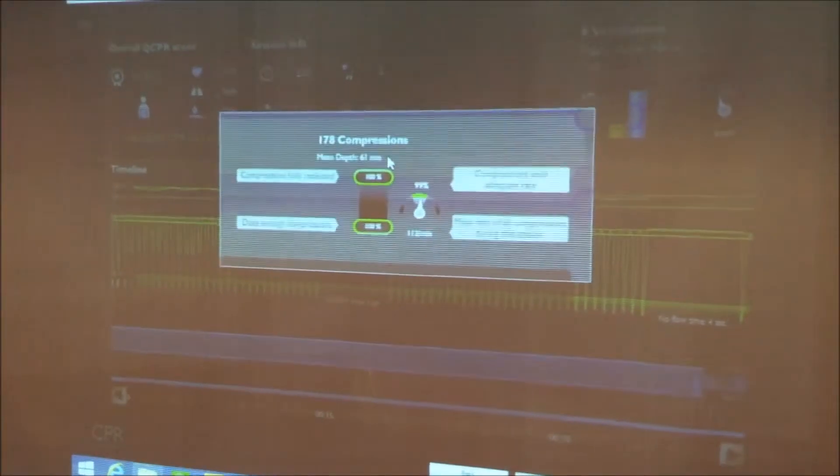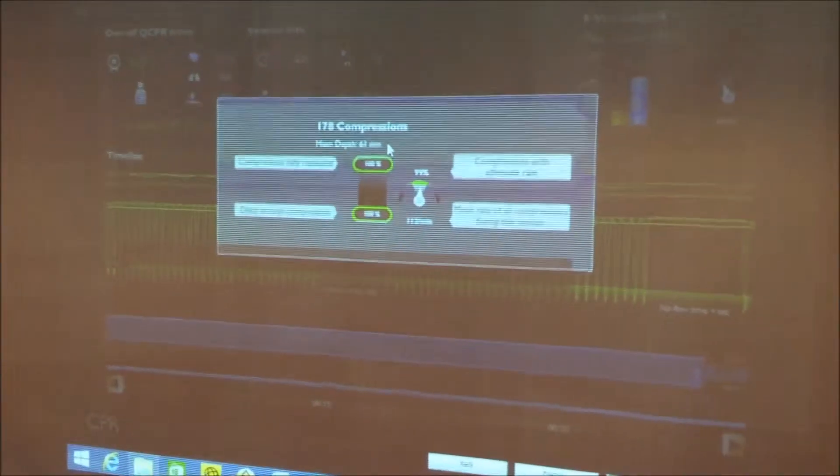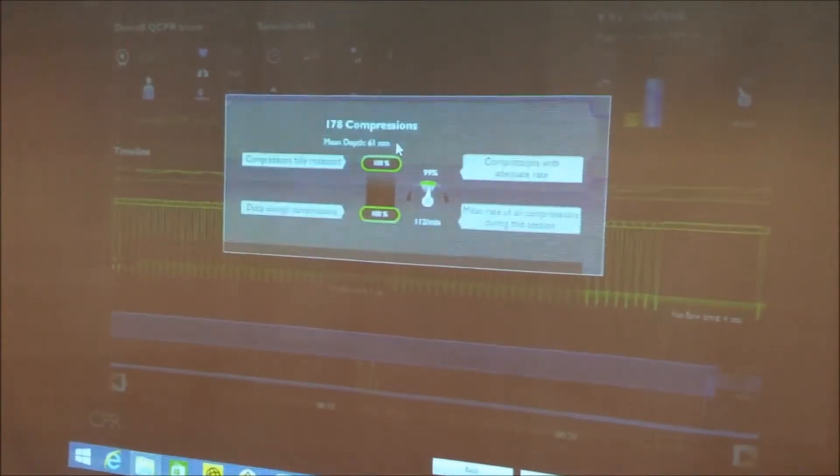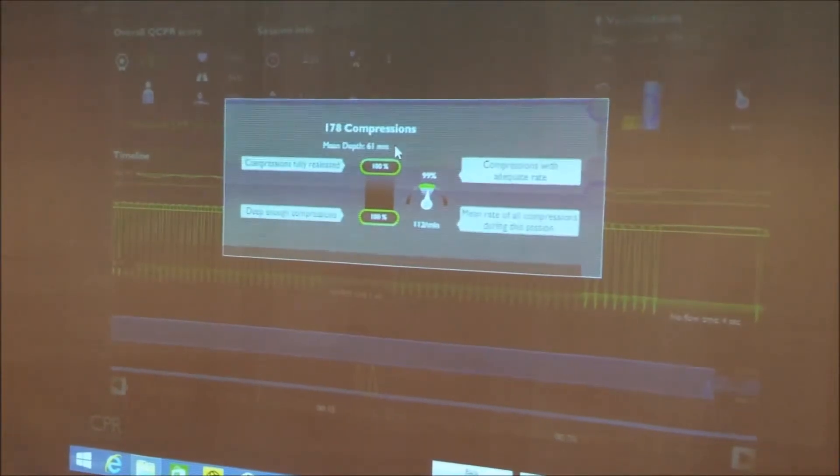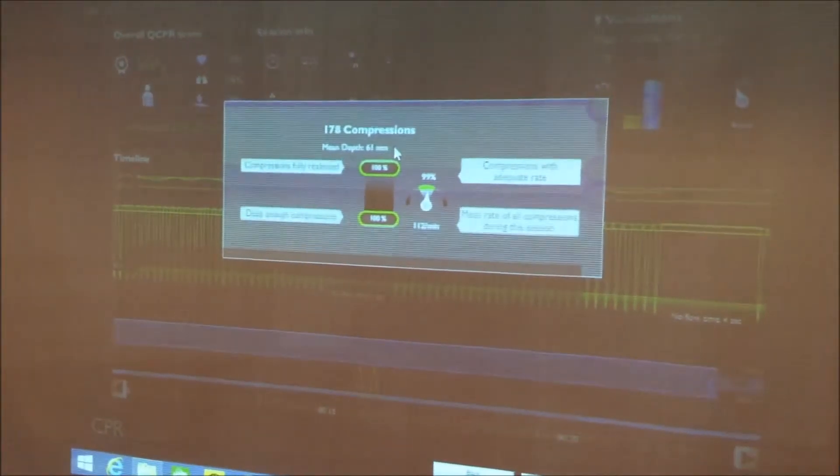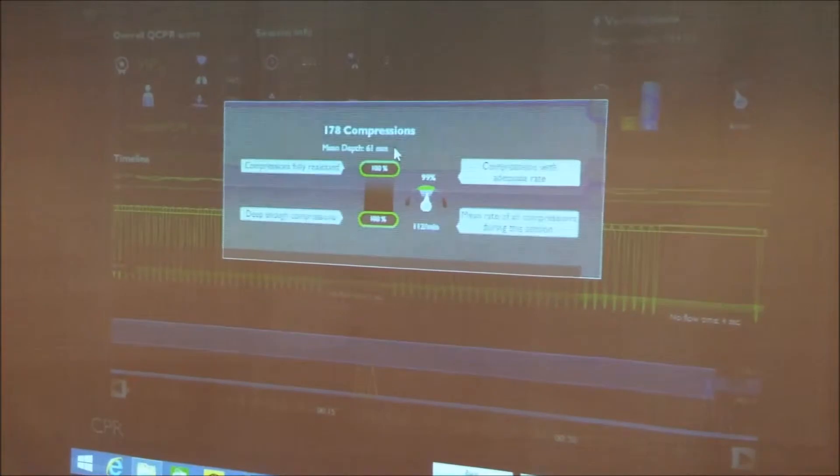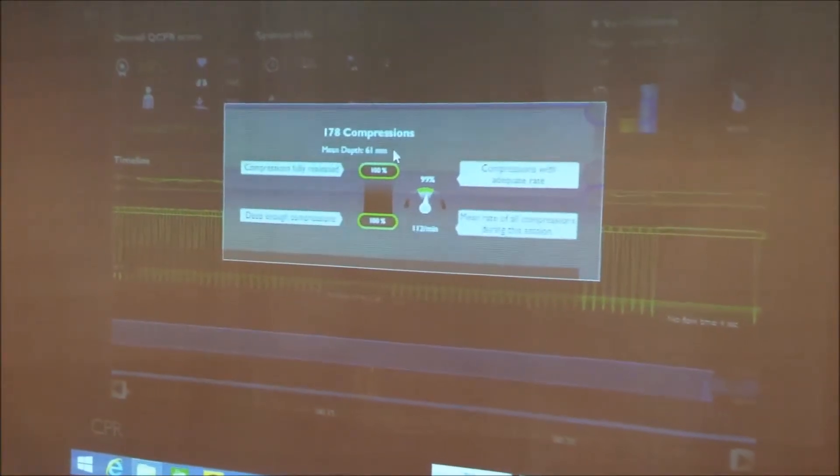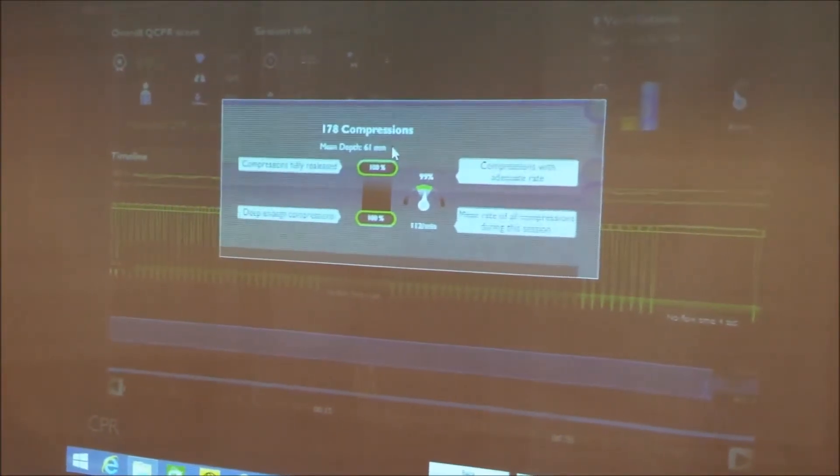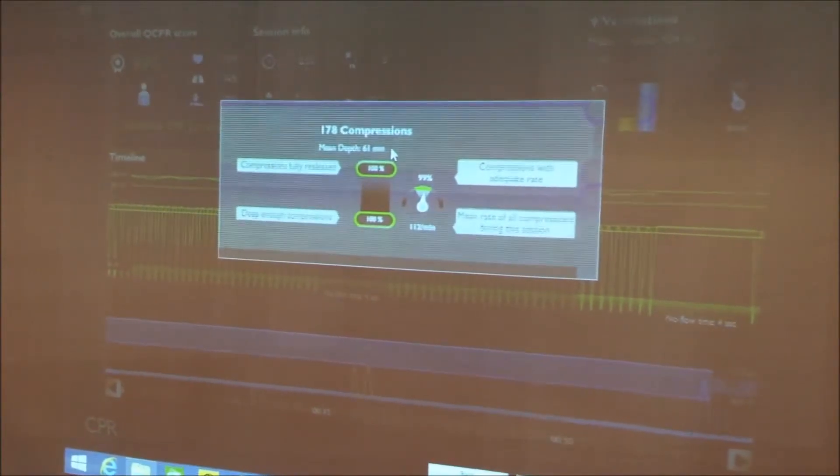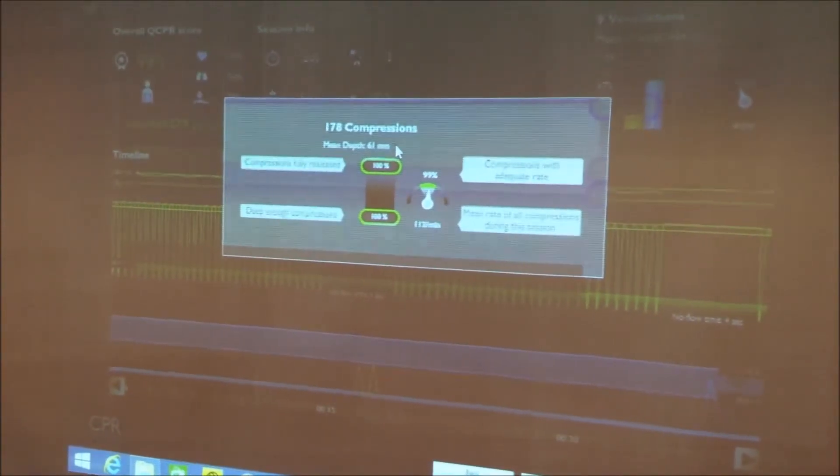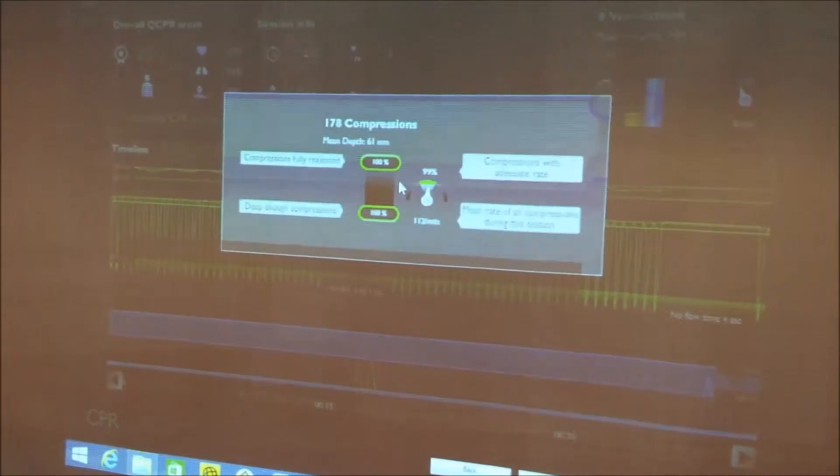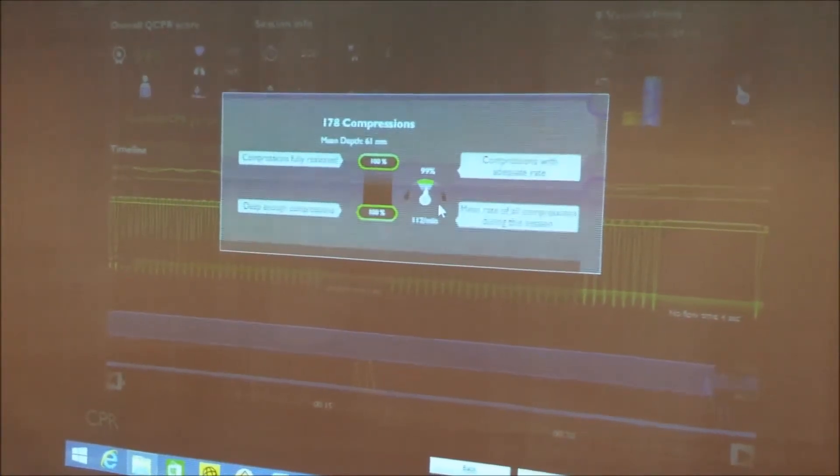I'm now going to move and have a look at compression data and we know that this person achieved a mean average depth of 61 millimeters or 6.1 centimeters. And again, based on global research, we now are aware that we need to attain or achieve a minimum depth of 50 millimeters or 5 centimeters because it's linked to much higher survival rates.